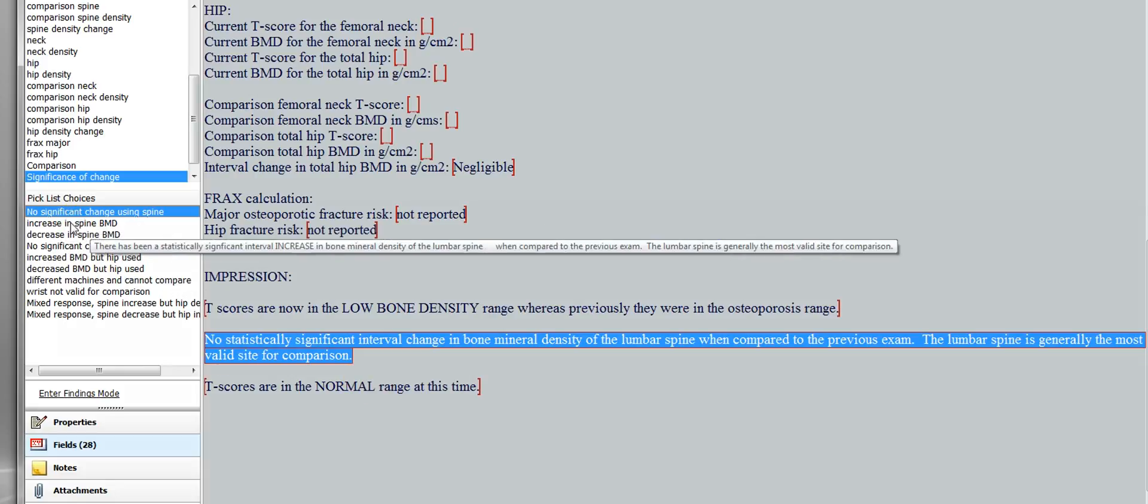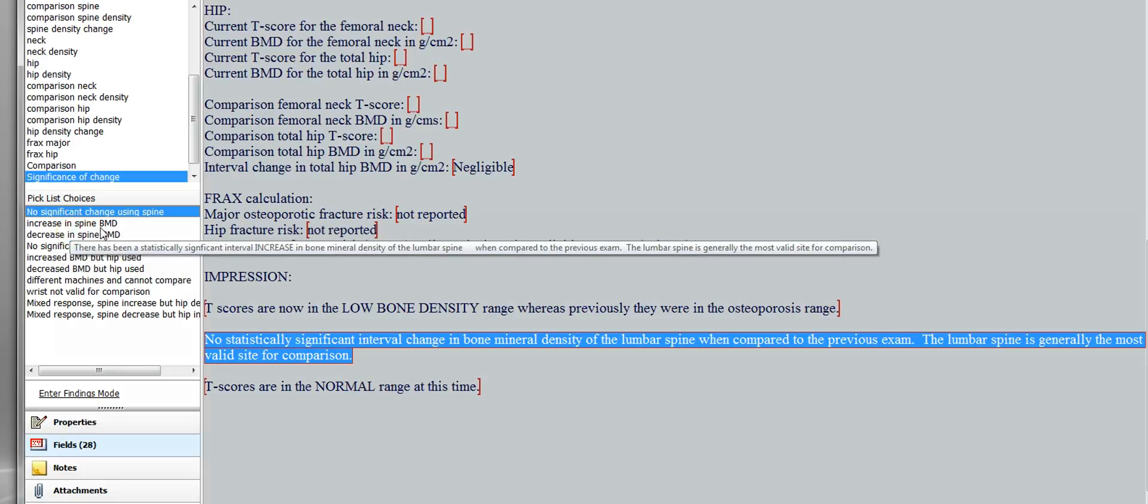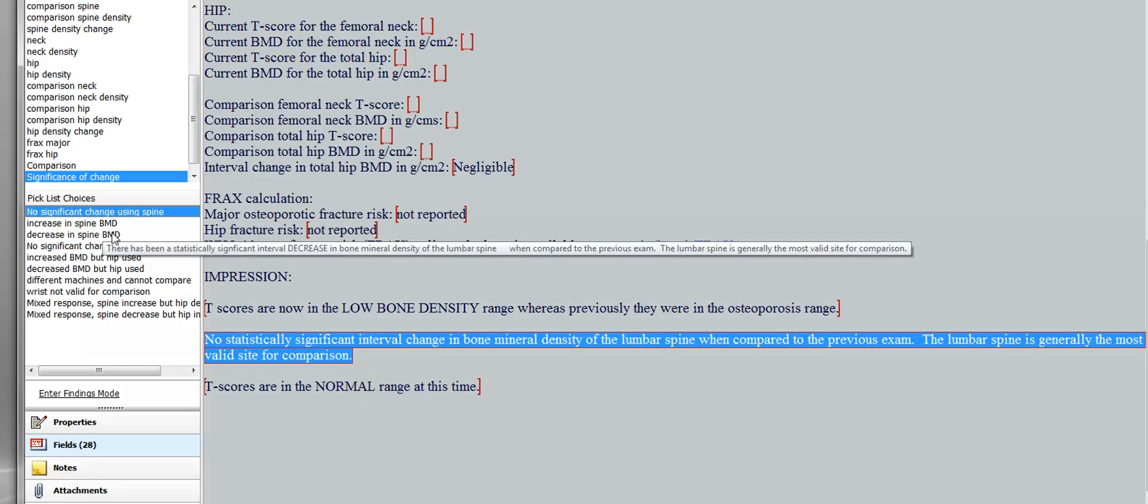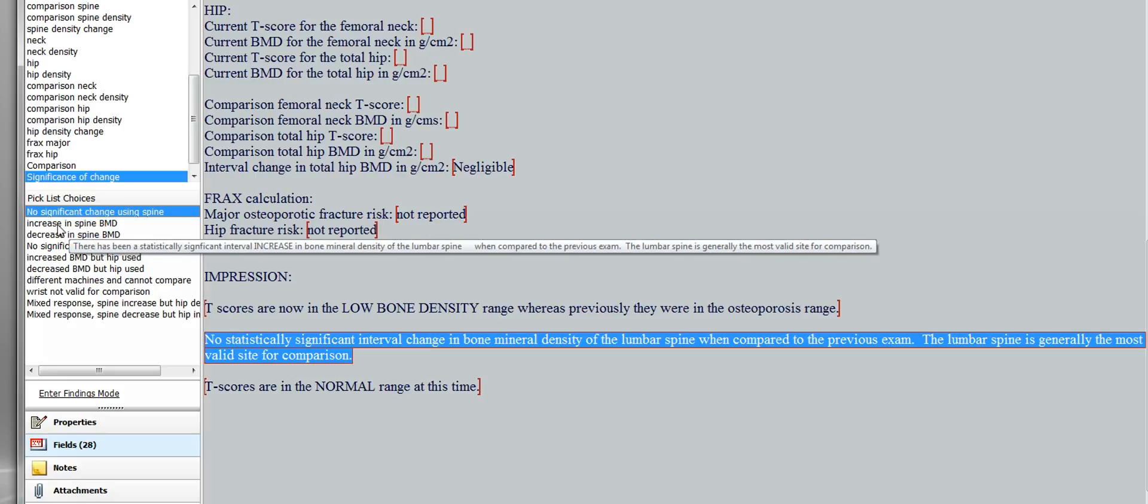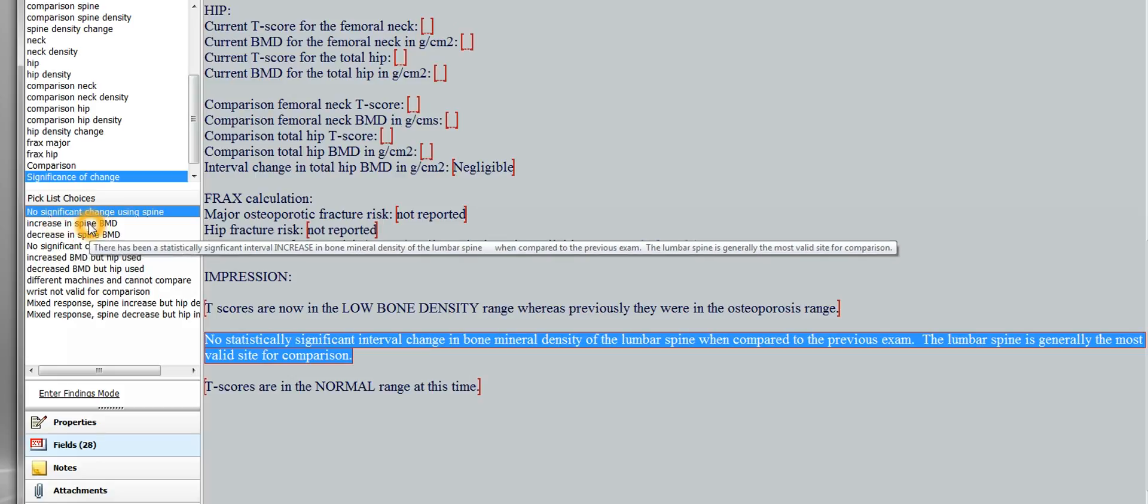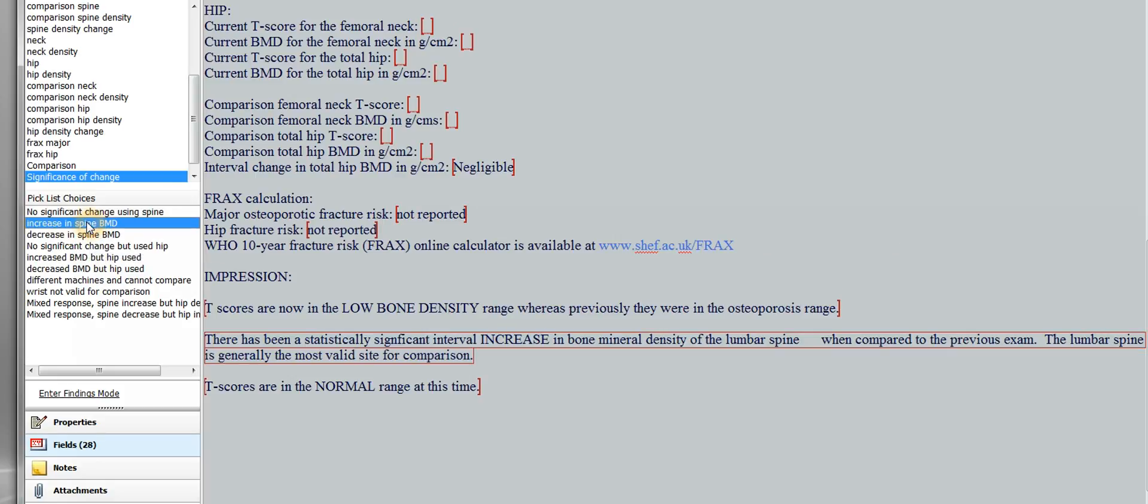But say that it has been a change. So say there's been a change in bone mineral density and you're going to statistically significant, and it's an increase, and you're going to use the spine. Then you would use this one. You say there has been a statistically significant interval increase in bone mineral density of the lumbar spine, with a blank, when compared to the previous exam. The lumbar spine is generally the most valid site for comparison.